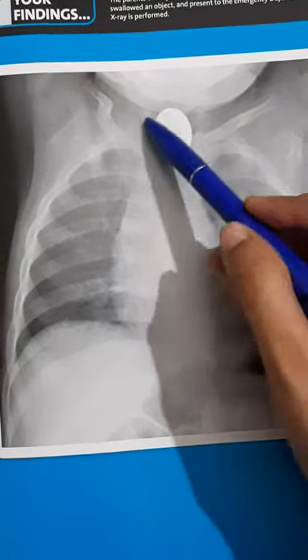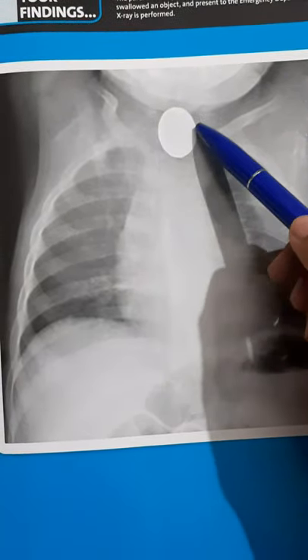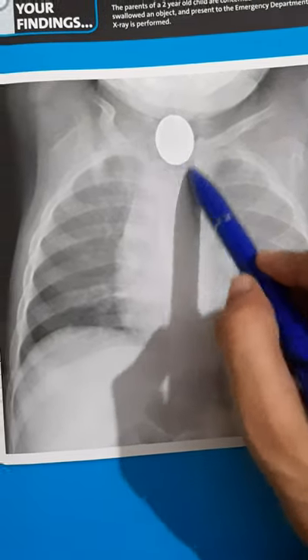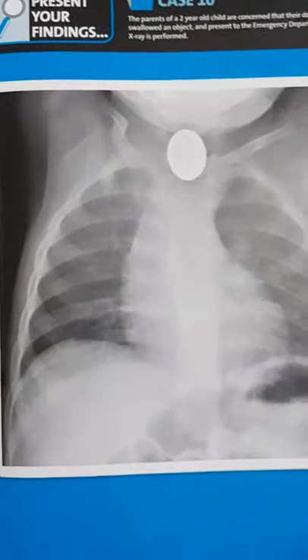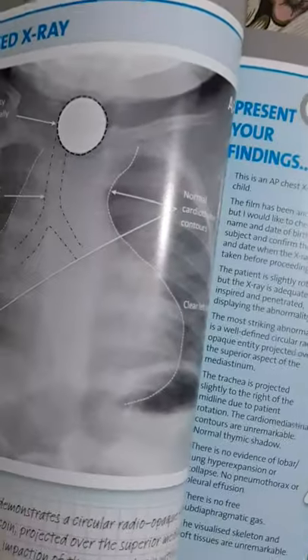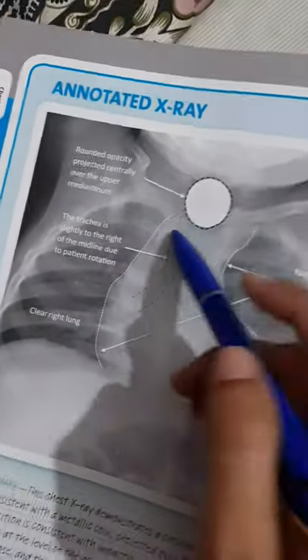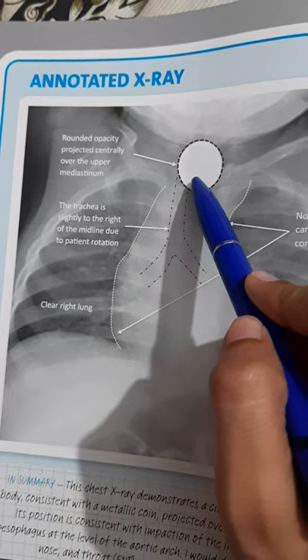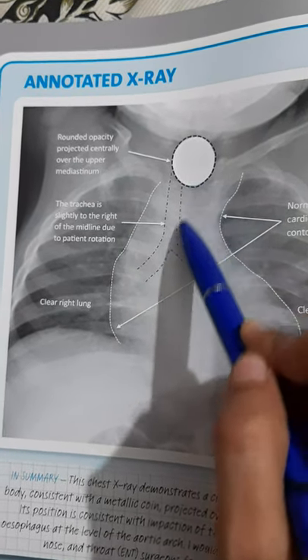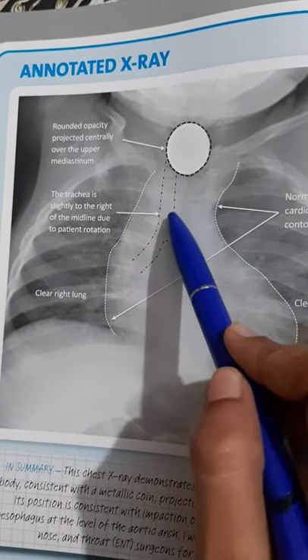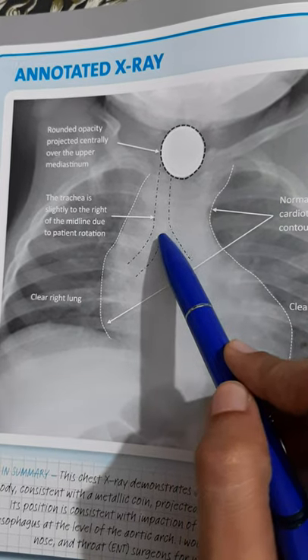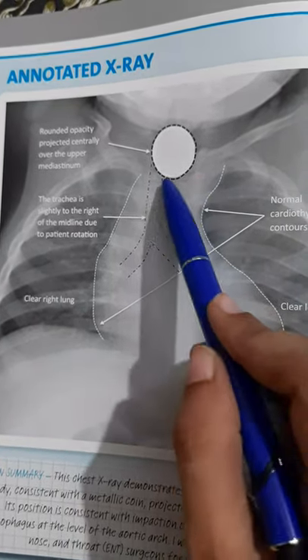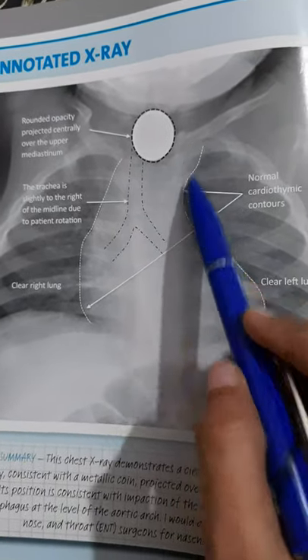We can see a clear opacification of an object on the x-ray. Coming towards the interpretation, this is a rounded opacity projected centrally over the upper mediastinum. The trachea is slightly to the right of the midline due to patient rotation, as we can see through the clavicle.